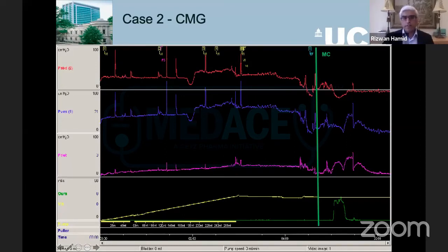You keep filling the patient up. These are mimicking each other. One can argue a little bit of pressure going up, but you can't see any detrusor overactivity, and the patient has got no urgency. So this is the filling phase, filled up to 200 mils, relatively flat line. If you see the lines going up here, that means the patient was either stood up or standing up. When these two lines go up together, that means the transducer levels have changed, but there is no change here. That means pretty stable.